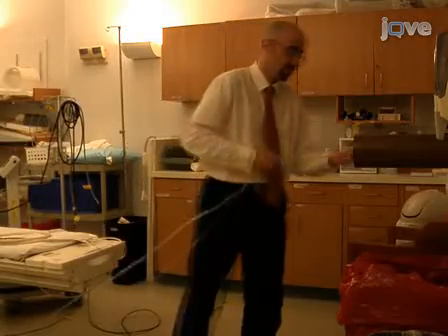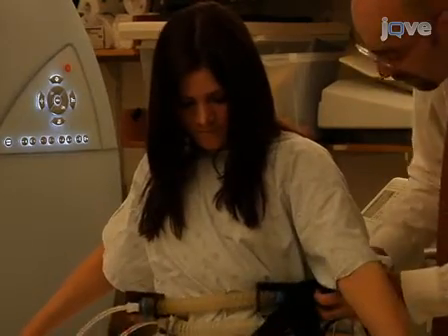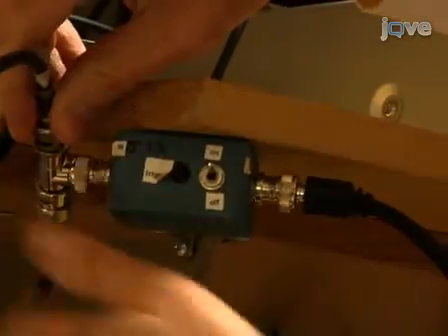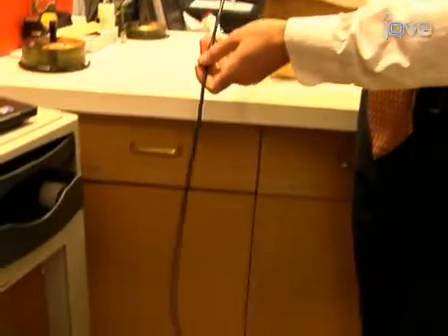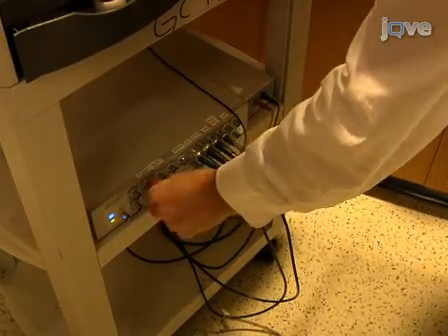To set up the respiratory belt system that is used to record respiration, plug the transducer into a power outlet in the scanner control room and feed the belt through the inlet into the scanner room. To synchronize the physiological data with the fMRI data, connect a BNC cable from the fMRI scanner trigger box to the PowerLab in the control room. The chart software can then be set up to start recording when a signal is received from the scanner.